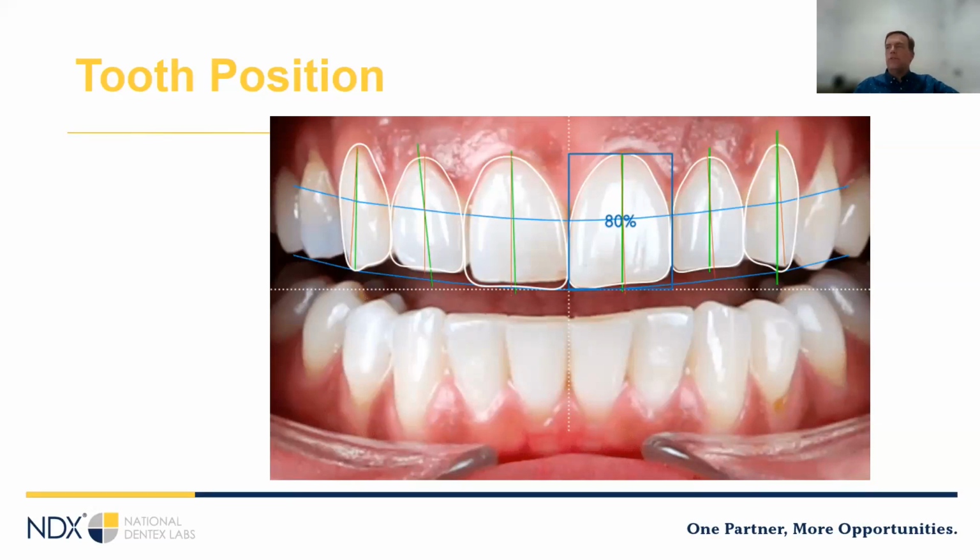Well, this is something you'll see more in your laboratory, but if you see a crown or some kind of restoration that looks kind of funny, sometimes it can be that the line angles aren't symmetric. The overall shape of the tooth is the same, but say one line angle is a little bit depressed or something like that. Another trick that we laboratories do that's good to think about is we want to close any dark triangles from the lingual.